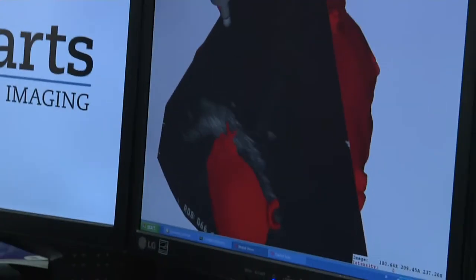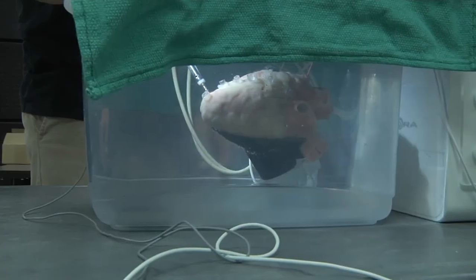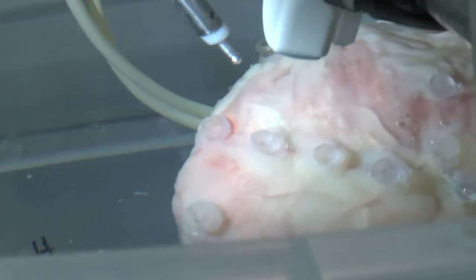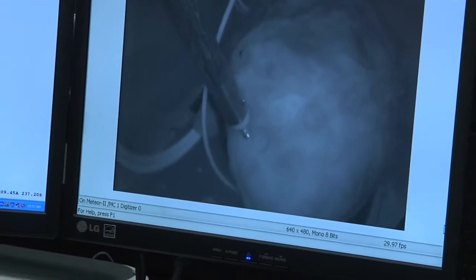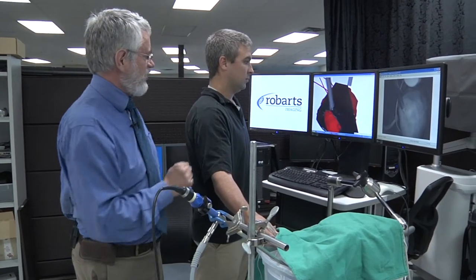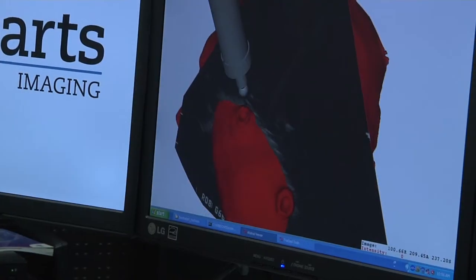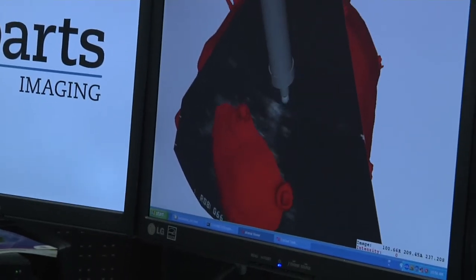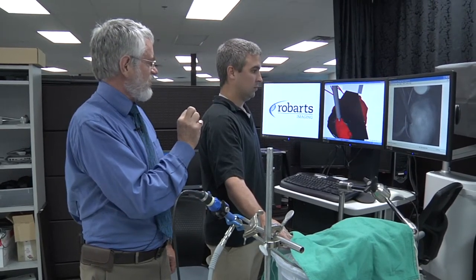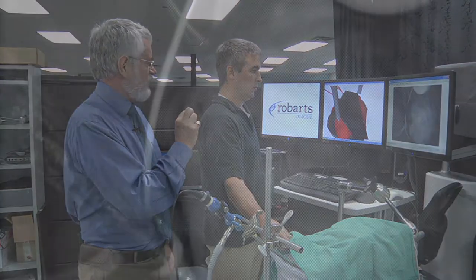If we look at these images on the screen, we can see by virtue of this endoscopic camera what is actually going on, but this is not what the surgeon sees. What the surgeon sees is the preoperative model, which is showing up as red on the left, and he sees the ultrasound. By using the screen, the surgeon can place the instrument in the appropriate place by being guided by the ultrasound and the virtual model shown on the left.